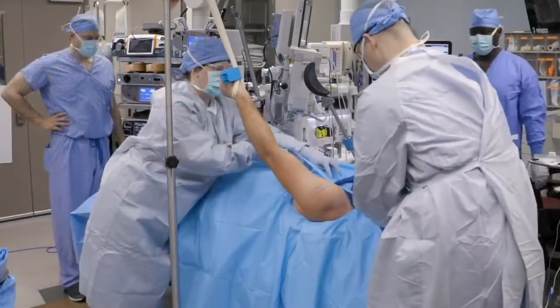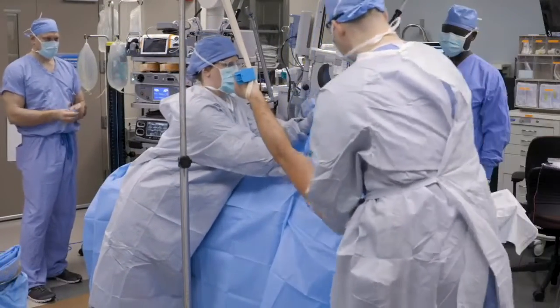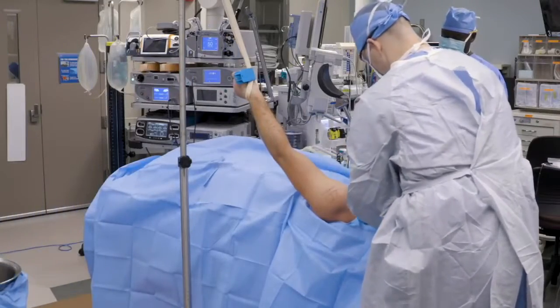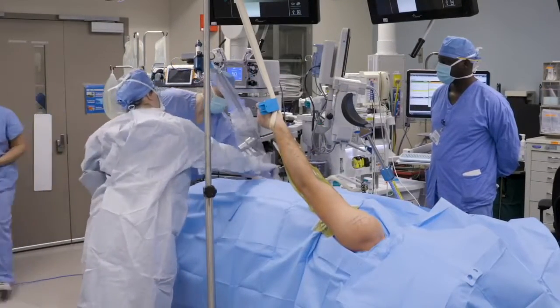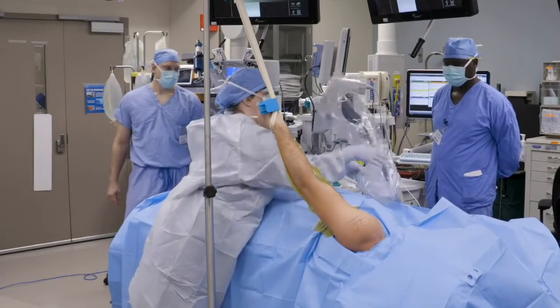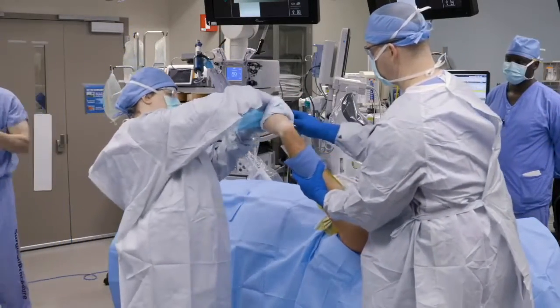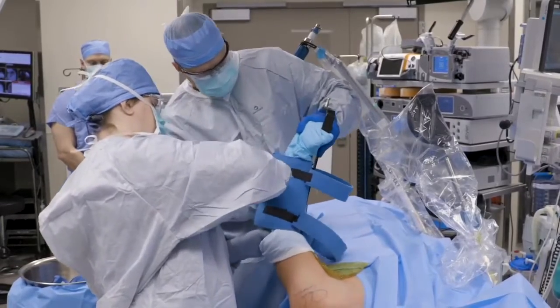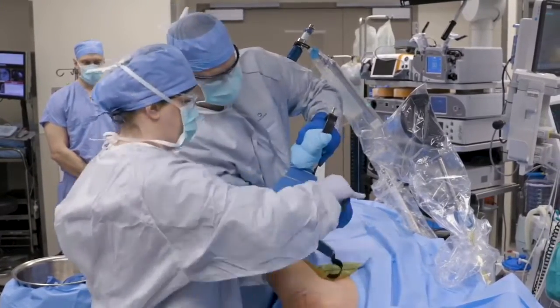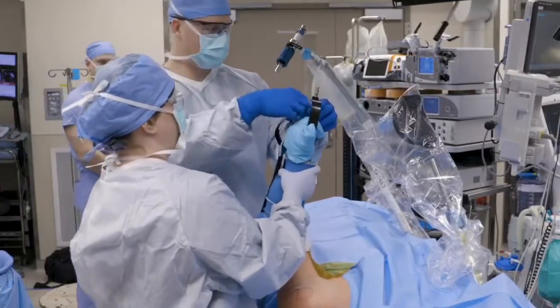The patient is prepped in the standard fashion. U-drapes are placed above and below the arm to secure it circumferentially. An impervious drape is then applied and wrapped all the way around the shoulder, taking great care to ensure that the entire scapula is prepped into the field. A sterile sleeve is placed over the mechanical arm holder and the same is repeated for the bolster. The arm is taken out of the prepping suspension and an impervious stockinette is placed over the hand and arm, rolled up beyond the level of the elbow. The appropriate arm holder is then strapped securely into place.